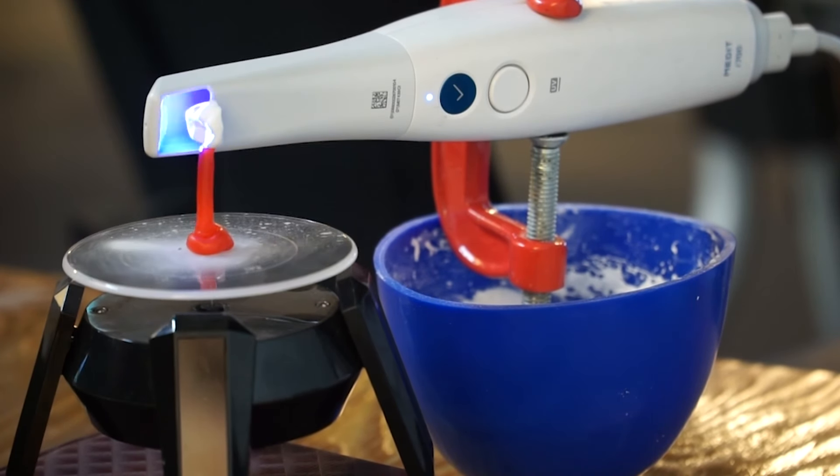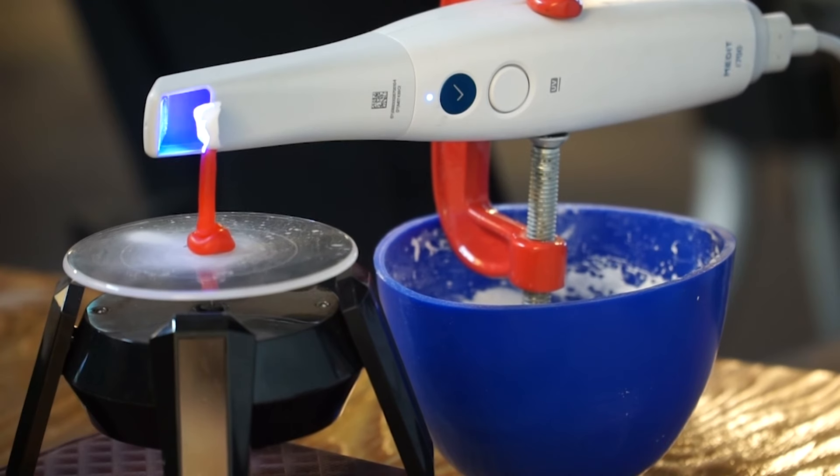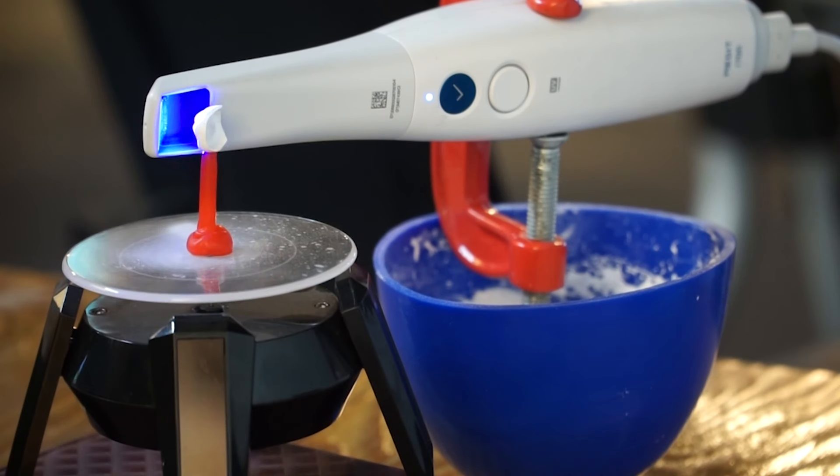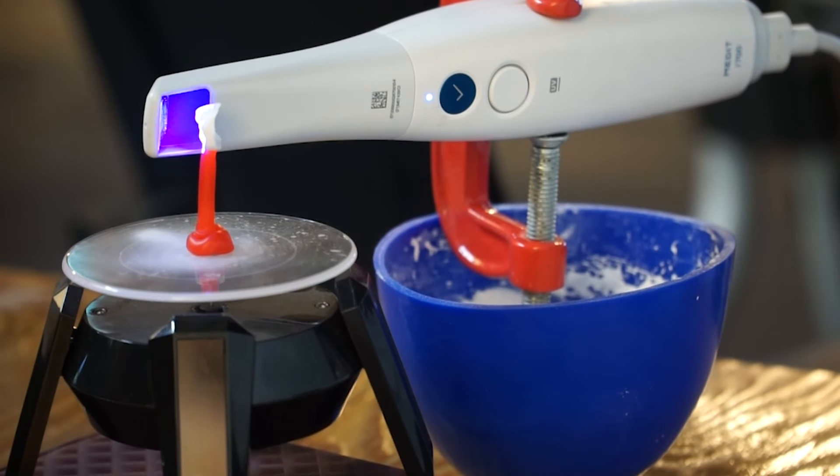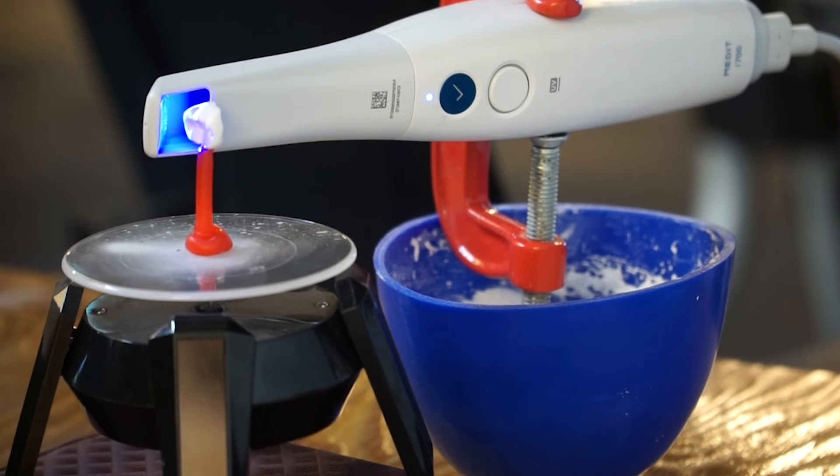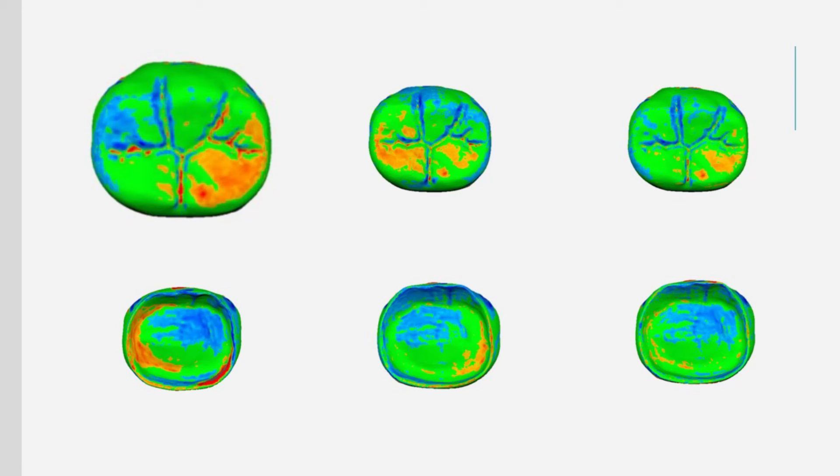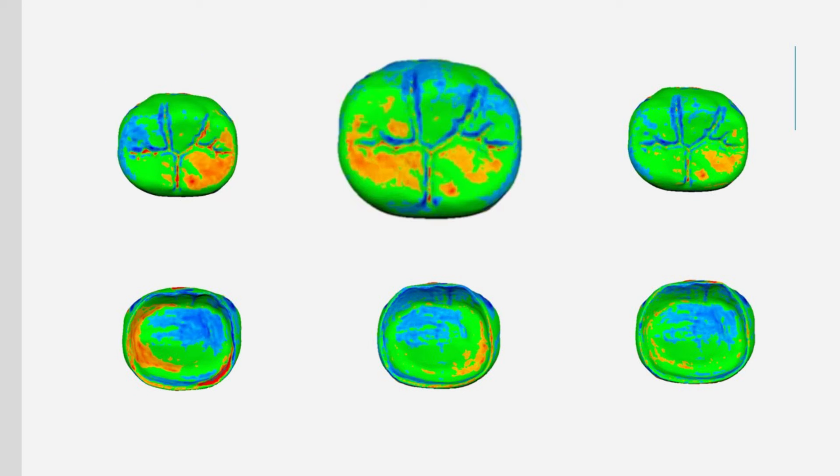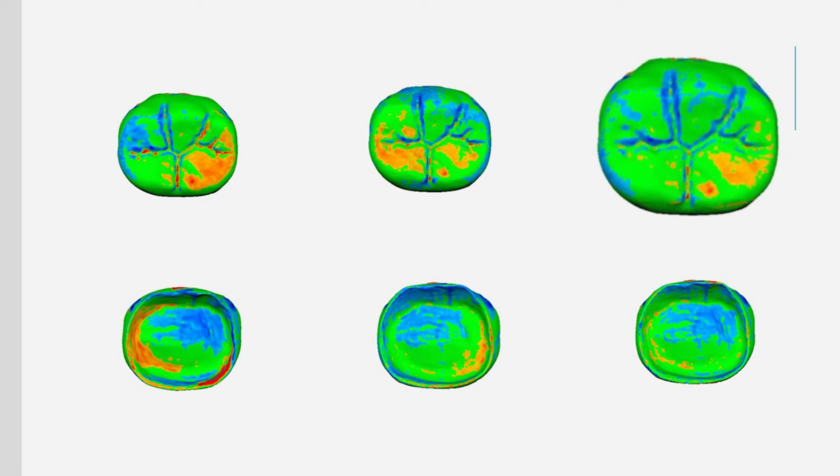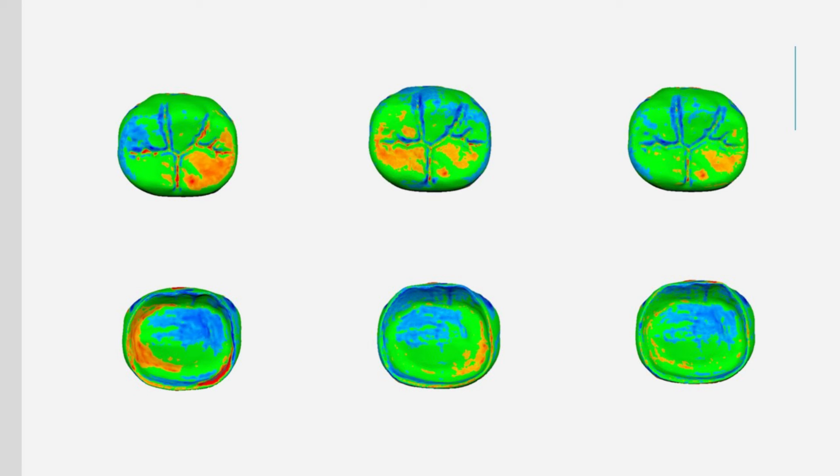As long as you keep a constant focal length, I think it's better to scan without interruption to reduce errors. On the left is the result of scanning with a gloved hand. In the middle is the result of scanning the wax with the handle. On the right is the result of scanning with the scanner fixed on a turntable. You can see that the results improve as you proceed from left to right.